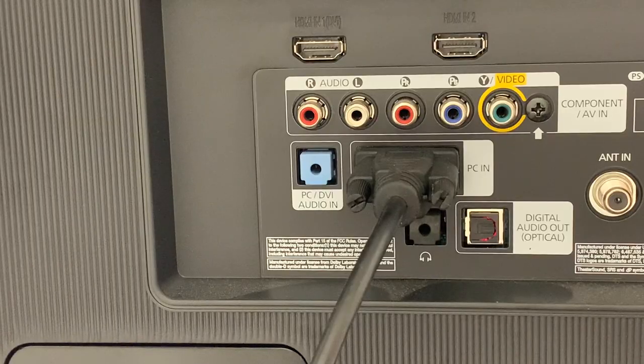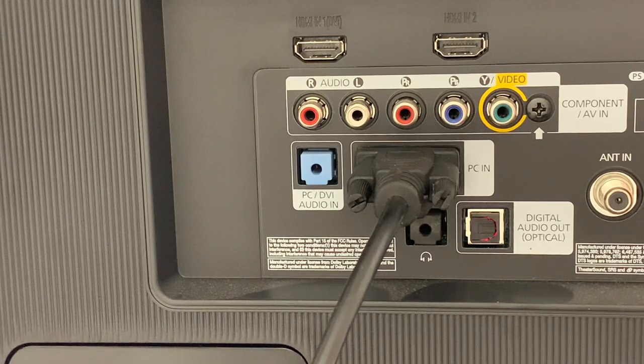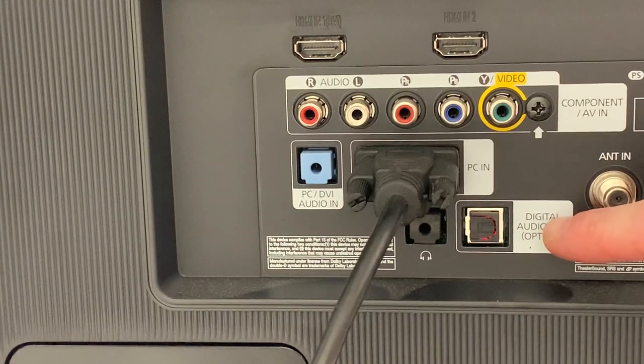So let's go ahead and hook up the cables. I'm using a compatible computer monitor. On the back of this monitor you can see the various inputs and outputs. What we're looking for in this case is the optical audio or digital audio output, located in the bottom right of this input-output panel.